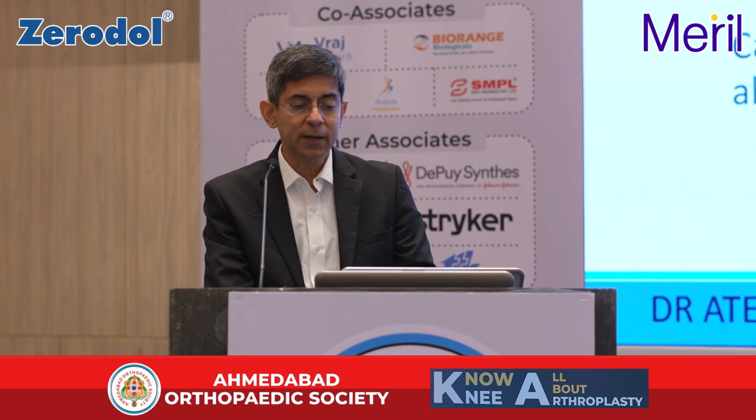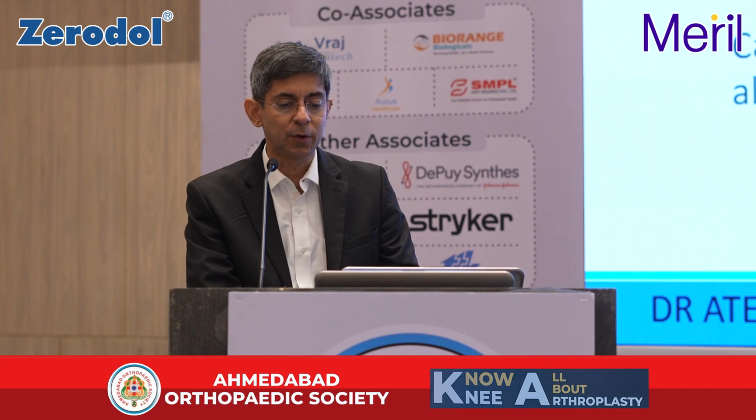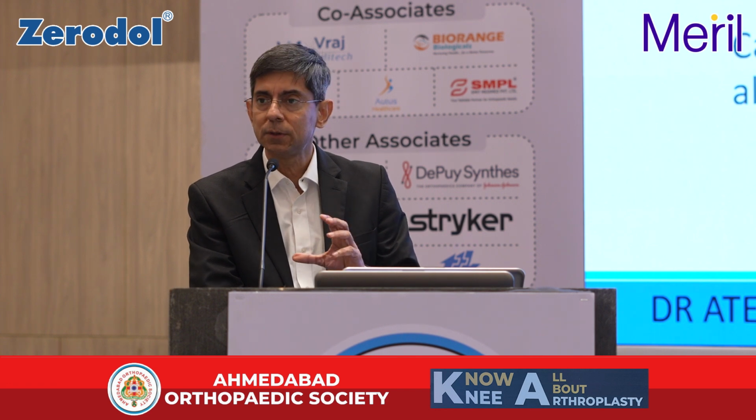So aseptic loosening can also occur due to disruption of the cement implant or the cement bone interface. Implant cement interface is the most common weak link compared to bone cement interface.